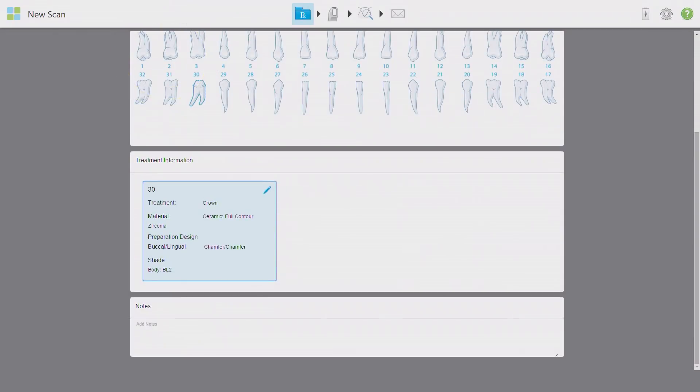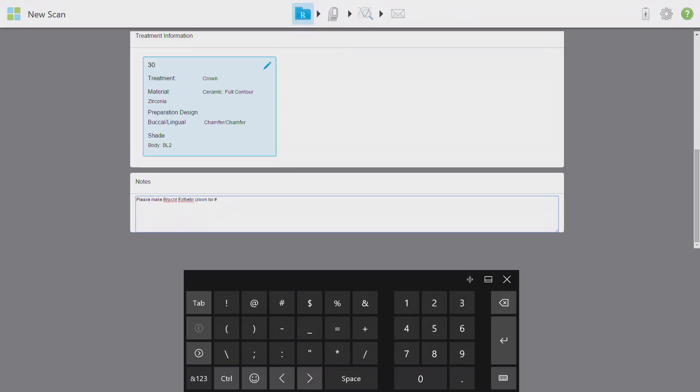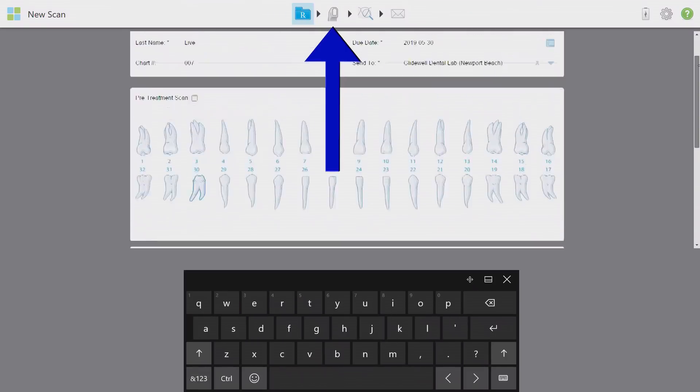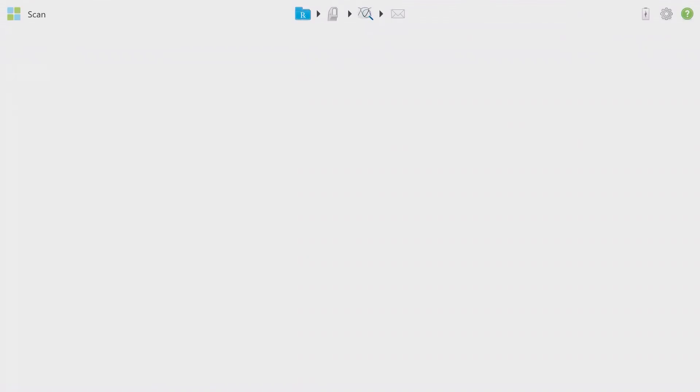Press the back button once all entries are complete, then enter any specific notes about the case in the notes section. This is your chance to specify the exact product as well as any unique instructions the lab needs to know. Even if this case is being sent to your own chairside mill, enter all of these details in notes so you can refer back to them later. From here, click the scan button on top of the screen and leave the iTero in this ready position.